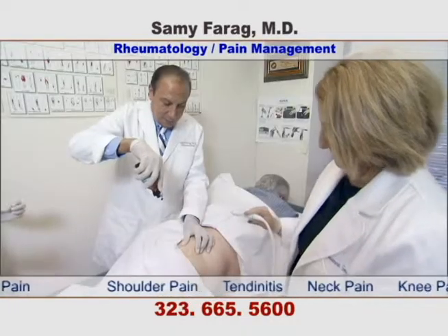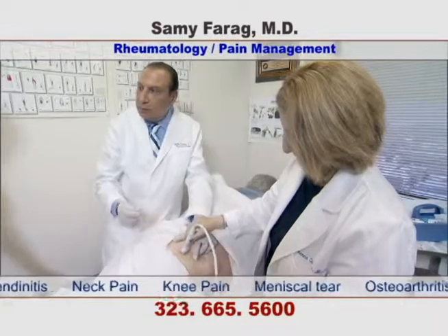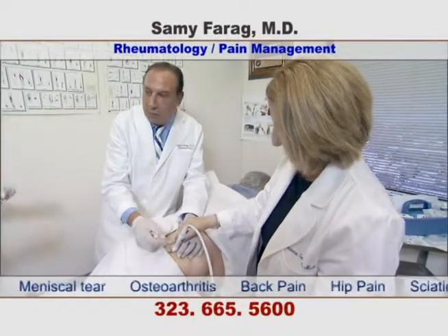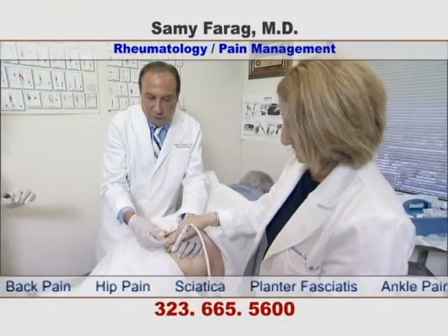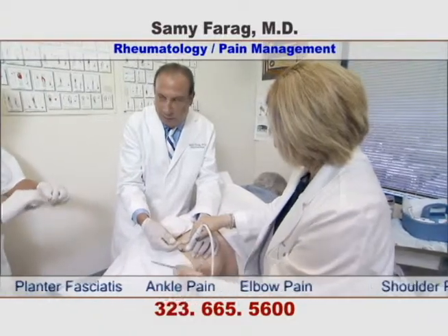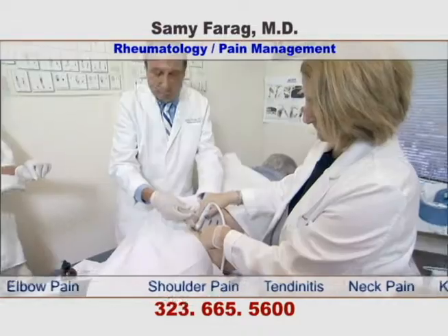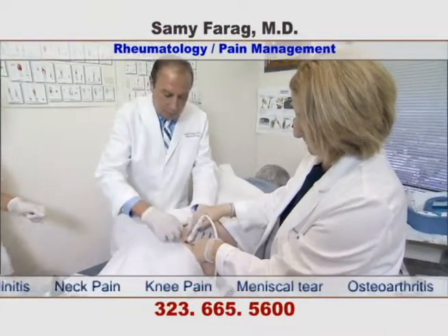A freezing spray is used to numb the skin. This patient suffers from sciatica. As you can see, the doctor is injecting into the piriformis muscle. This is a successful procedure with an 80% success rate.